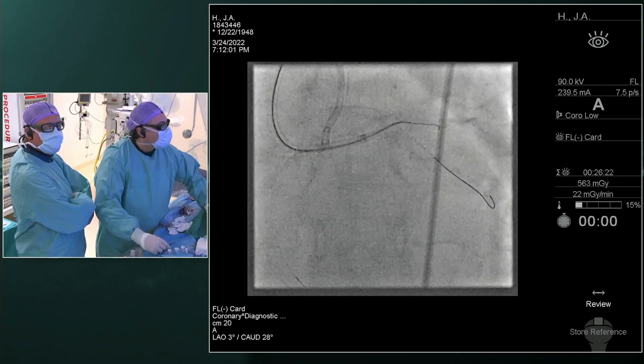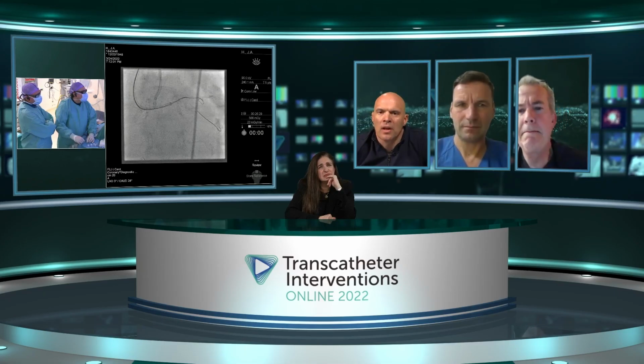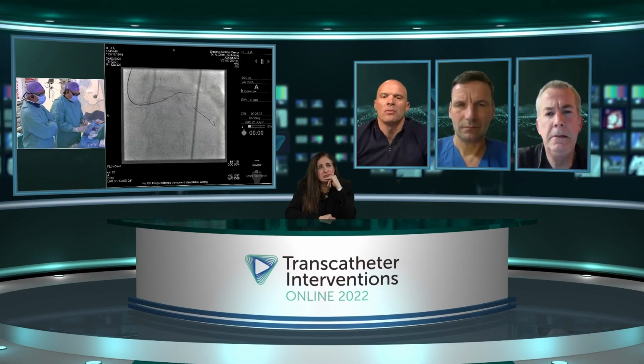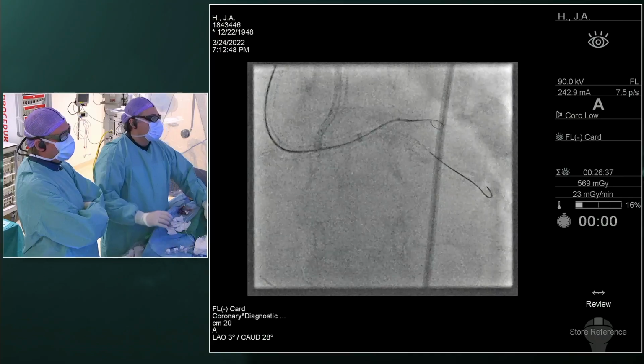You are confident that your stent in the circumflex is outside of the left main. You already know that, so that's good. What about because you're struggling with the support? Would you go for a guide extension at this point, or say no? Let's keep on trying now. No, guide extension is very good.